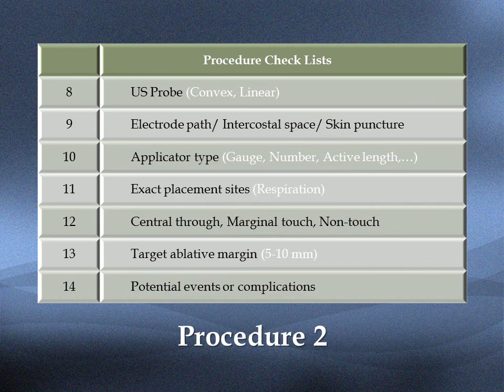Specific electrode path, specific intercostal space, applicator type, including number and active length, exact placement site, central tumor through, marginal touch or non-touch technique, target ablative margin, potential event or complication.